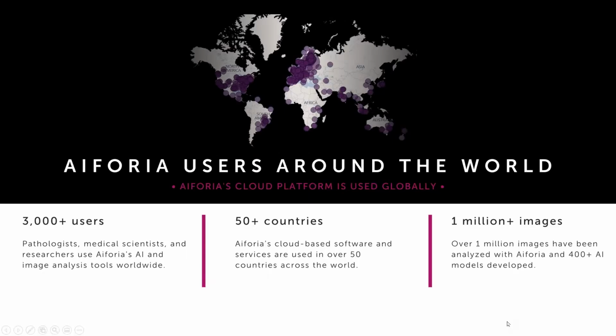I just wanted to give you an idea of who all of our Aiforians are. Our Aiforia users really do exist around the world. There are 3,000 plus users in over 50 countries, and we have processed and analyzed over 1 million images with over 400 AI models. So there's quite a breadth of models that we've developed and that our customers have developed in several different uses. For instance, we have pathologists, medical scientists, researchers, and clinicians that all use Aiforia, not only for image management, but for AI model development.